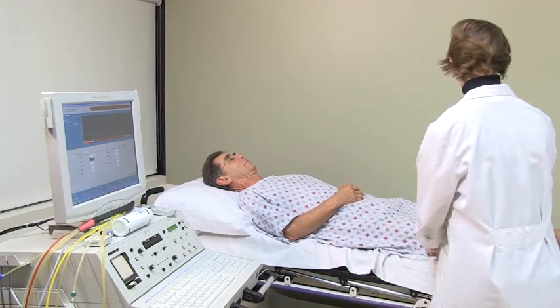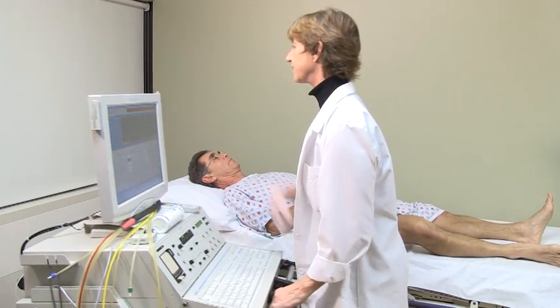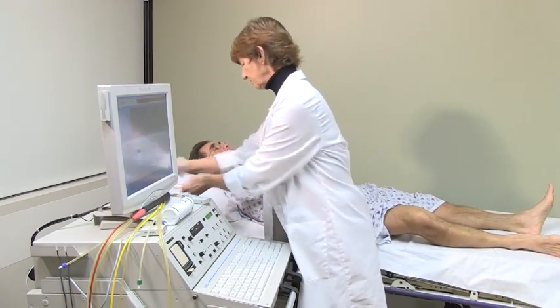You will need to remove your pants, shoes, and socks, and a sheet will be provided, or you may be asked to wear a gown. You will then be asked to lie on a comfortable exam table.